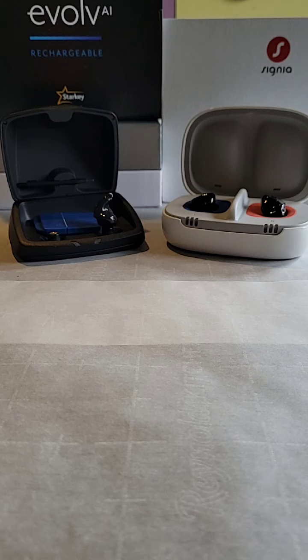So I'm real particular about my music. I like a very warm sound. My music, I like a little bit more low end and bass, not so much the high piercing sounds. So the Evolves have more of that. They have a better reproduction of streaming audio than the Signias do. The Signias, no matter what we did to tweak them, I never got the low end that I really wanted. Not that I got it fully on the Evolves, but the Evolves were better. These aren't going to be like JBLs that you stick in there and you get that real thumpy low end, because they aren't designed to do that. The drivers and things inside these hearing aids aren't made to reproduce music perfectly. They're designed to recreate ambient noise and boost and enhance and increase the volume so you can hear it.